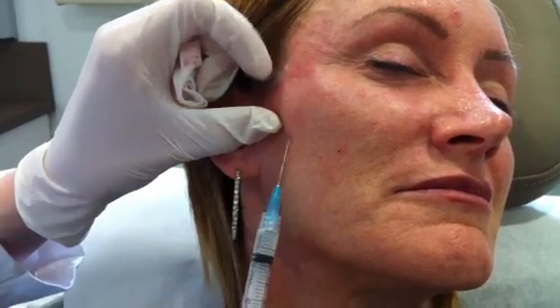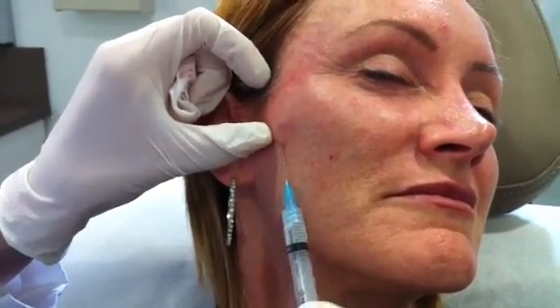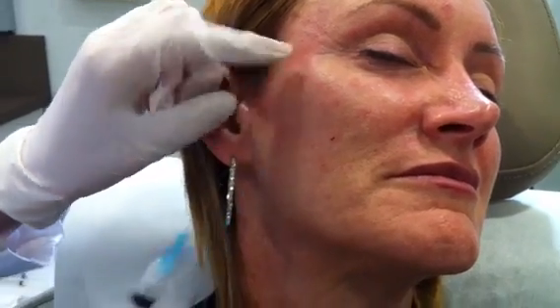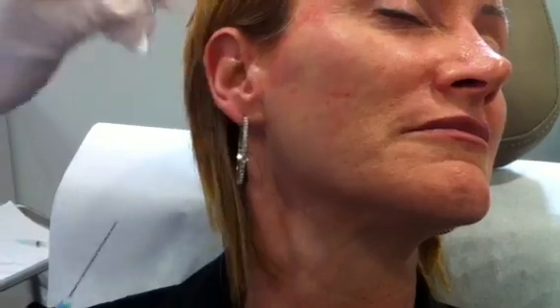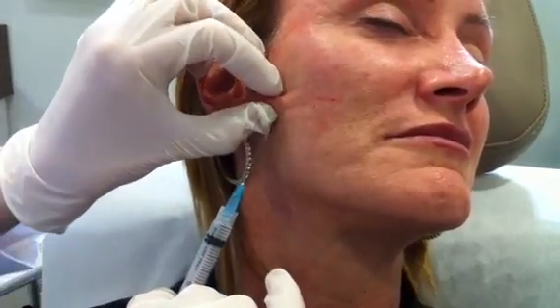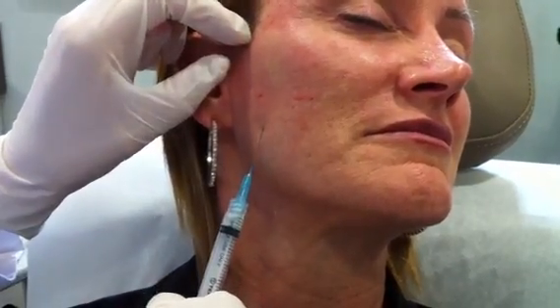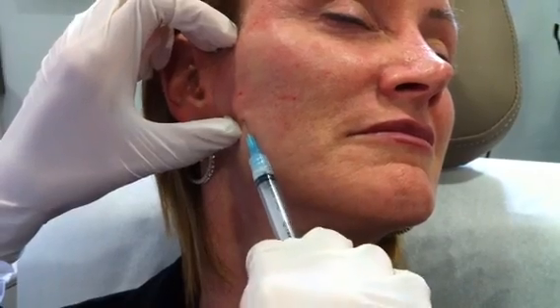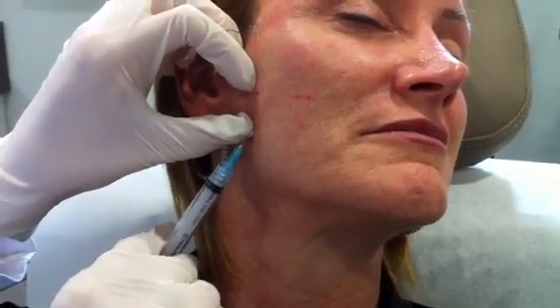And I tell patients as I work back here that occasionally the numbing that's actually in the Sculptra that we incorporated can cause the upper eyelid just temporarily to be a little bit sleepy. And then often people lose a little bit of volume in this zone, so we're just going to put a little bit in this area. Here we're staying still in the subcutaneous compartment, but superficially. There's something called your parotid gland there, and we don't want to work deeply in this zone, but this is an area that has a tendency to lose volume over time.